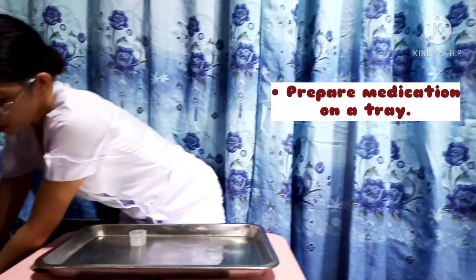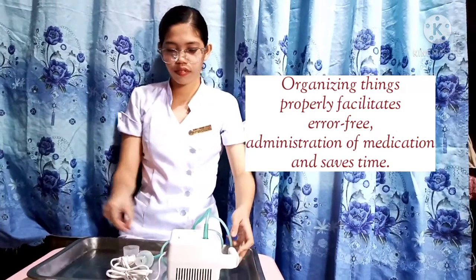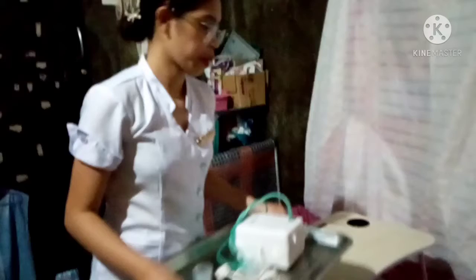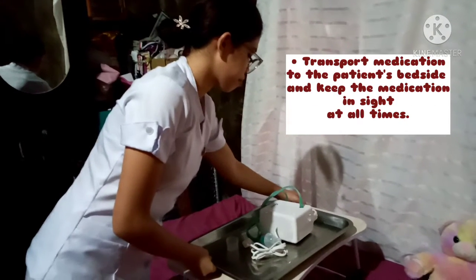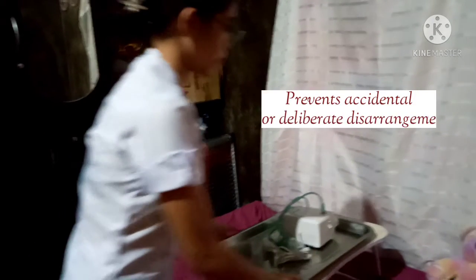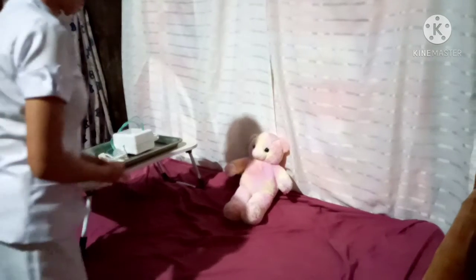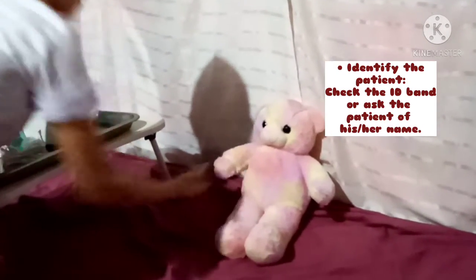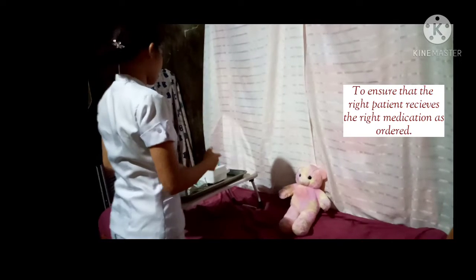Prepare medications on a tray. Organizing things properly facilitates error-free administration of medication and saves time. Transport medication to the patient's bedside and keep the medication inside at all times. This prevents accidental or deliberate disarrangement of medication. Identify the patient. Check the ID band or ask the patient for his or her name. This step ensures that the right patient receives the right medication as ordered.